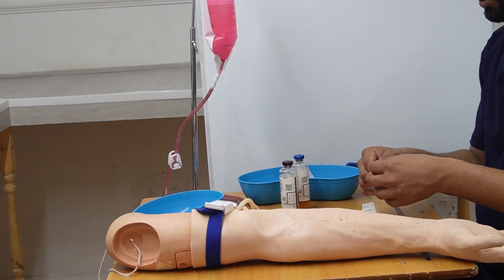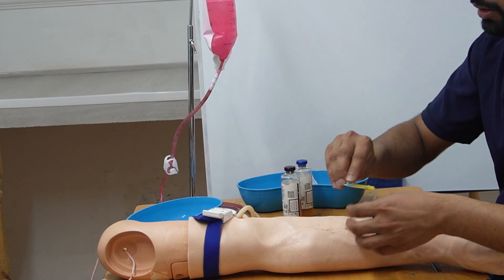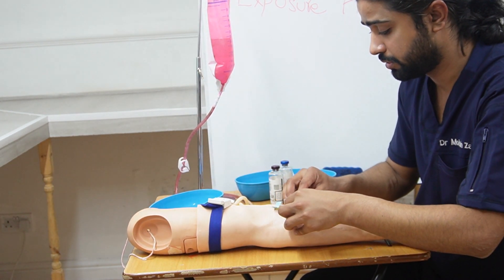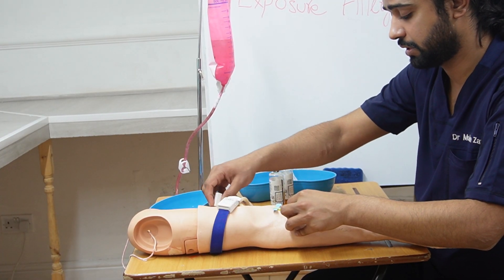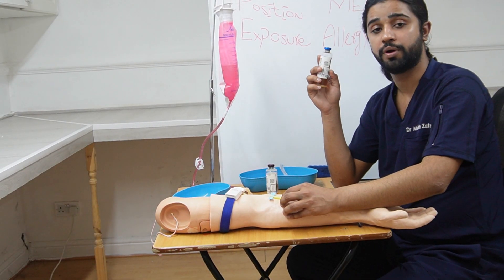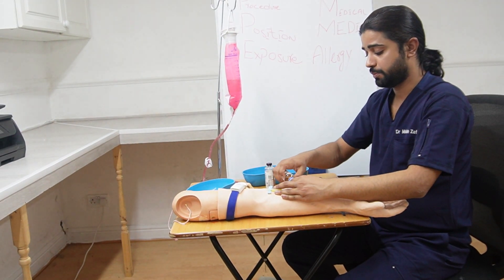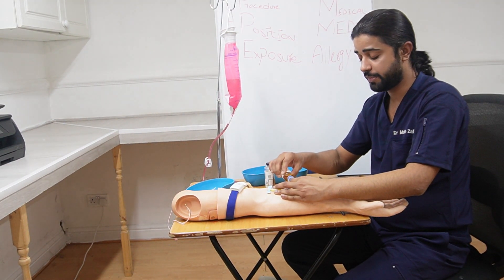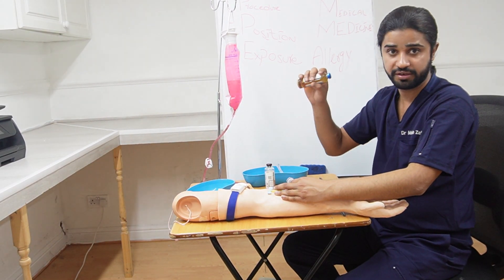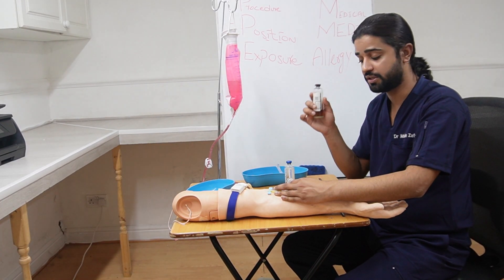Clean the area with a single stroke. Take the cap off the needle and let the patient know that a sharp scratch is coming. As soon as you see blood flashback, release the tourniquet. Then take the culture bottle — first use the blue one, which is aerobic. Insert it, take the sample, and fill it up to the marking indicated on the bottle, then rotate it 180 degrees.